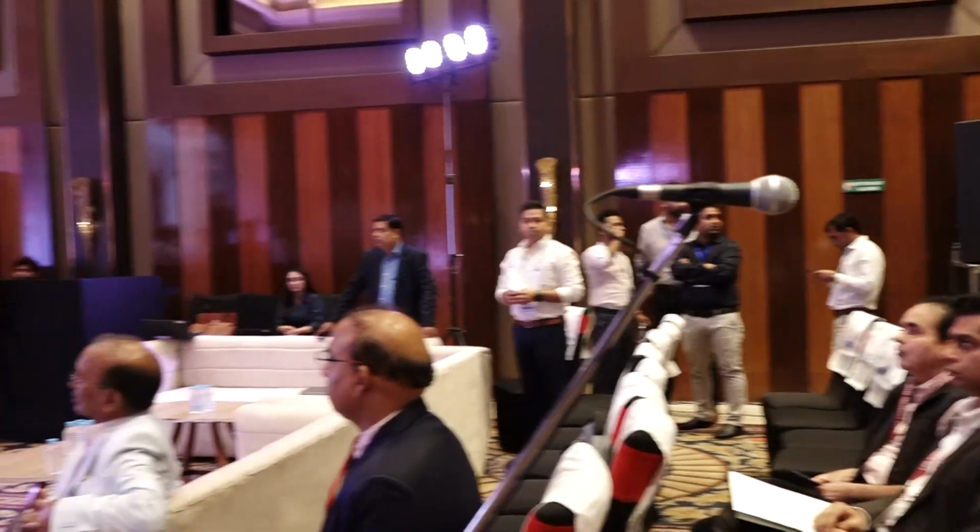So I would always prefer, where the MCL is actually stretched, a 1 or 2 degree of varus alignment overall, not even neutral. It's not a question of what you feel on the table. That's only 5-10 kg. But 70 kg going on for the next 10-15 years will stretch out the MCL, and that's a disaster for a knee replacement. So you leave your knee in varus, Dr. Maheshwari, 0 degree or varus? 1 degree varus, not even neutral. So if my MCL is doubtful, 1 degree varus.